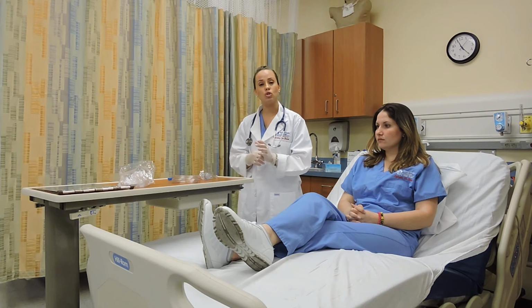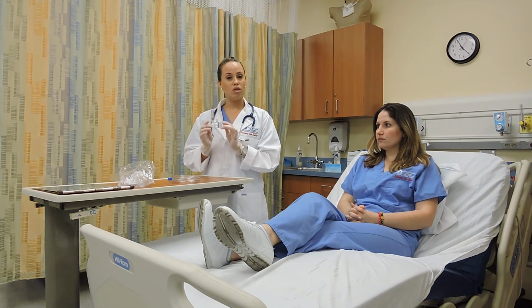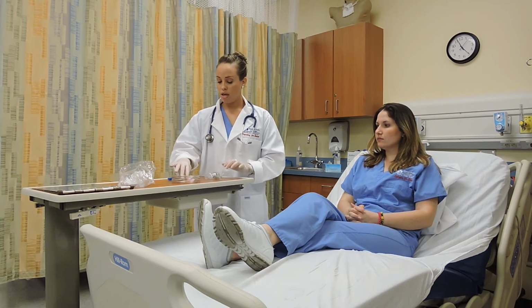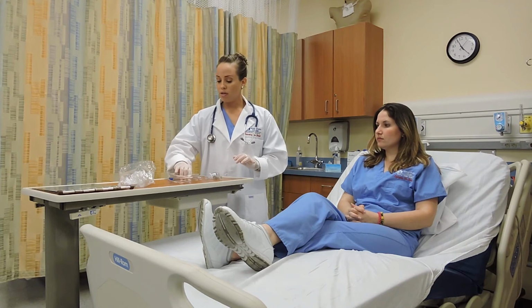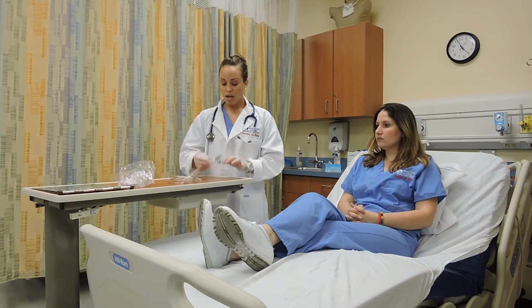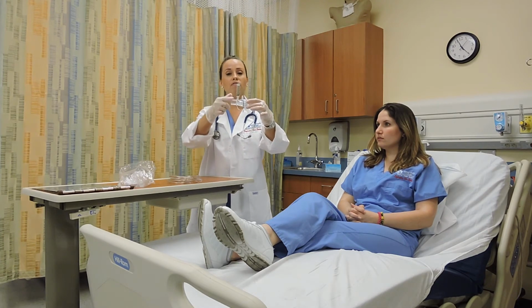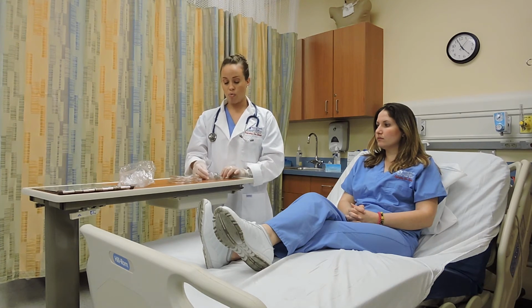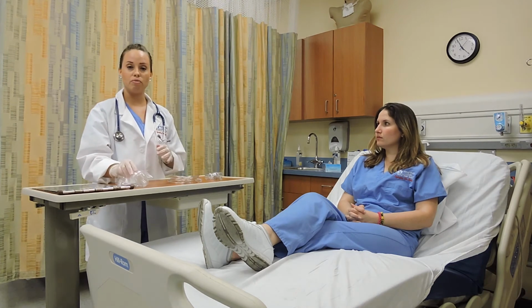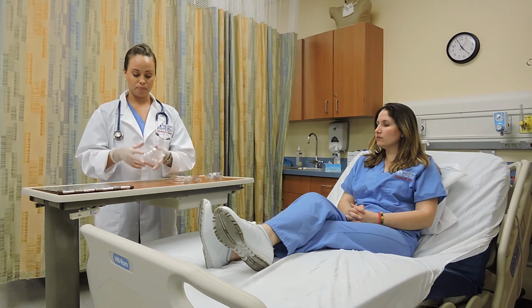Then we can proceed and start the therapy. For this therapy, we're gonna need the EzPap, as I mentioned earlier, and which you should have gathered prior coming to the patient's room, an oxygen tubing, and a nose clip also are going to be necessary. This equipment consists of a manometer, which will tell me if the patient is achieving an airway pressure of 10 to 20 centimeters of water, and a filter or a mouthpiece.